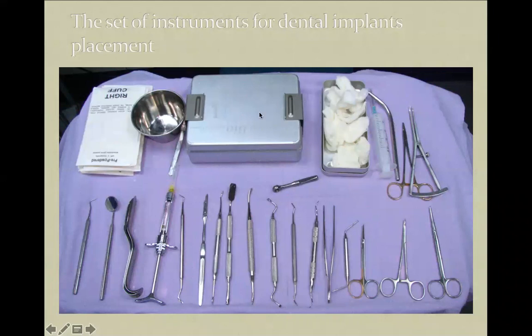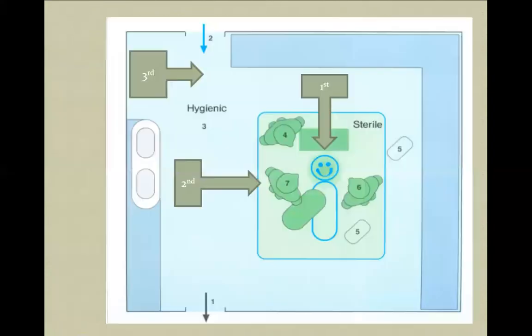And this is the implant drills set. That's the combination that is absolutely necessary for dental implant placement. We're always doing this design of our surgical instrumentation table.